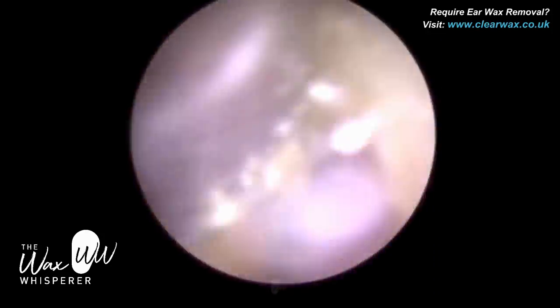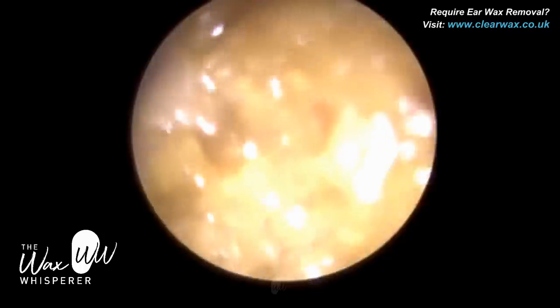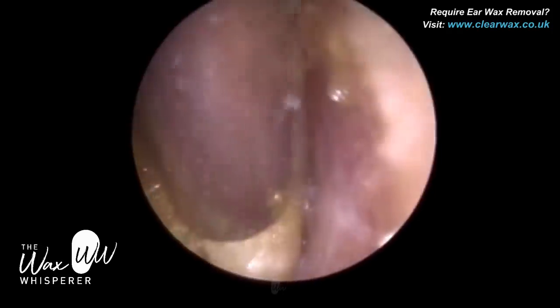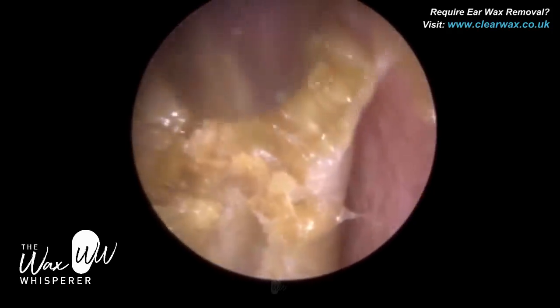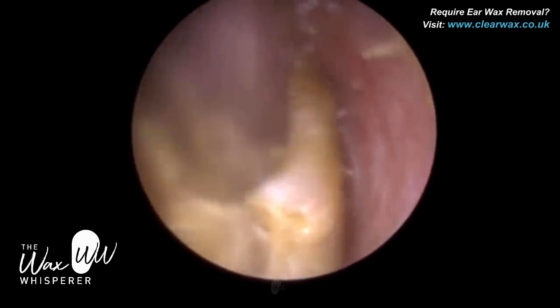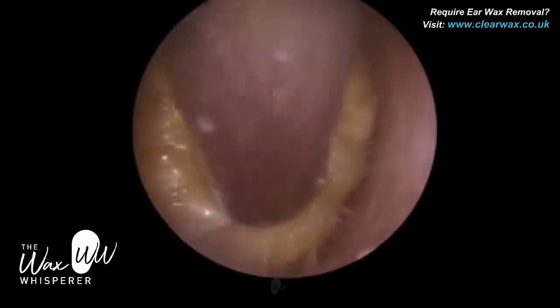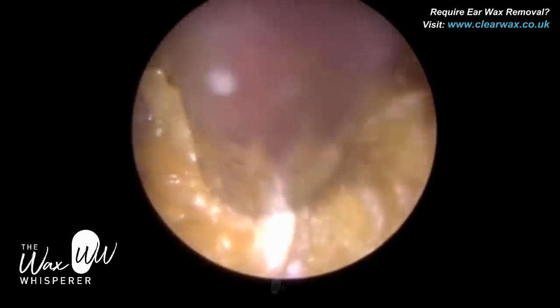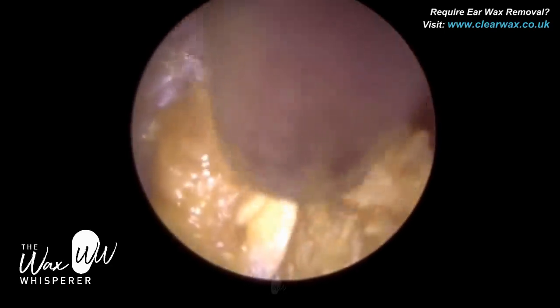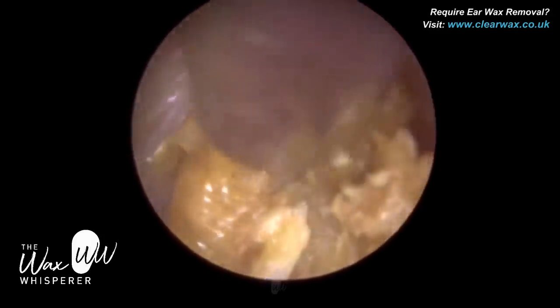So what I've done is instilled some olive oil earwax drops. What I find olive oil does is change the consistency of the earwax — it somewhat binds it together. Another food analogy: I always compare olive oil during a procedure to what an egg does in a fish cake or potato cake recipe — it binds all the ingredients together. So the olive oil has done a couple of things here: it's helped lubricate the ear canal wall, and also the inside of the suction probe. If we do get a partial blockage, the oil helps lubricate the wax to travel up the suction probe, and it's bound this wax together.